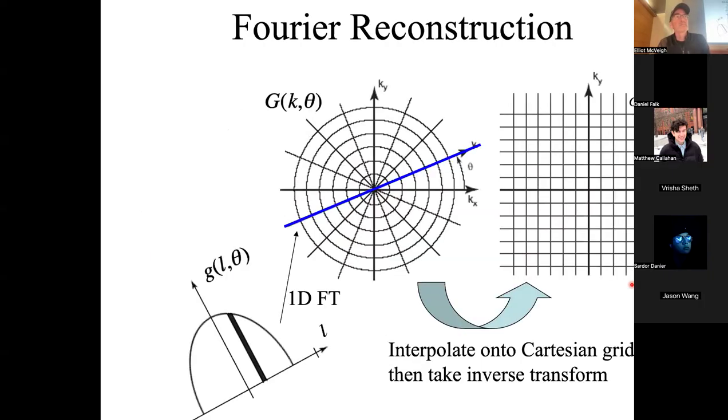That when it gets outside that there's less, are you talking about there's less measurements taken at those points, or just it's less energy and signal there? There's less. So the question is, as we go out here, what does it mean that there's less data right out here? So there's less data density, right?